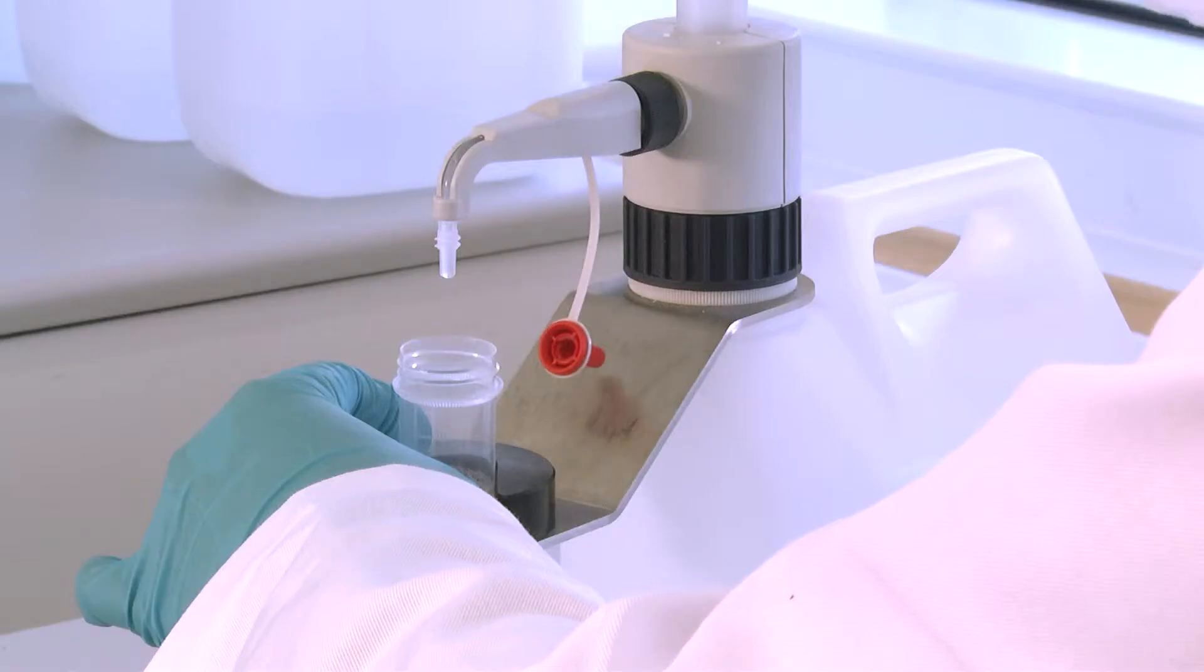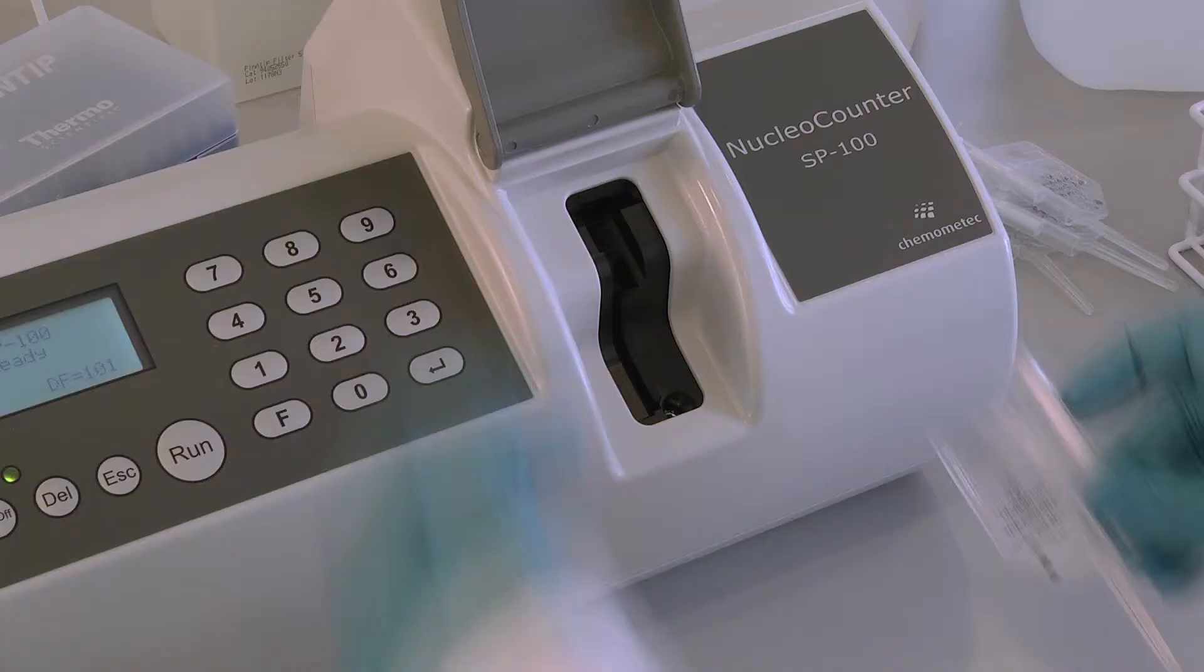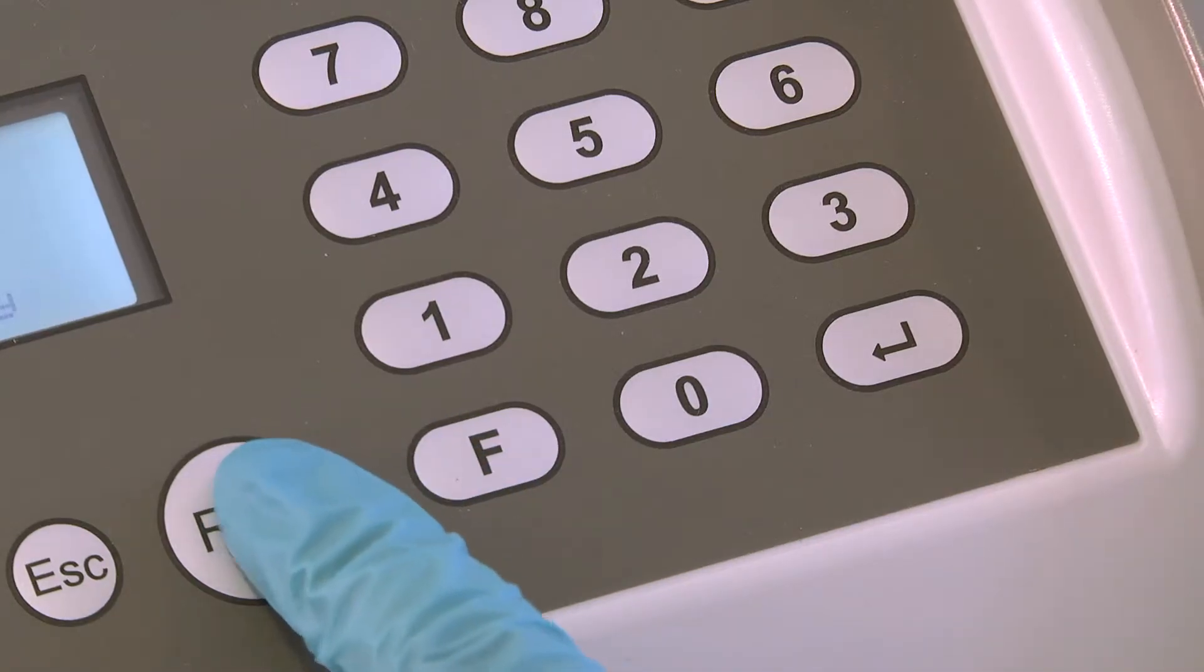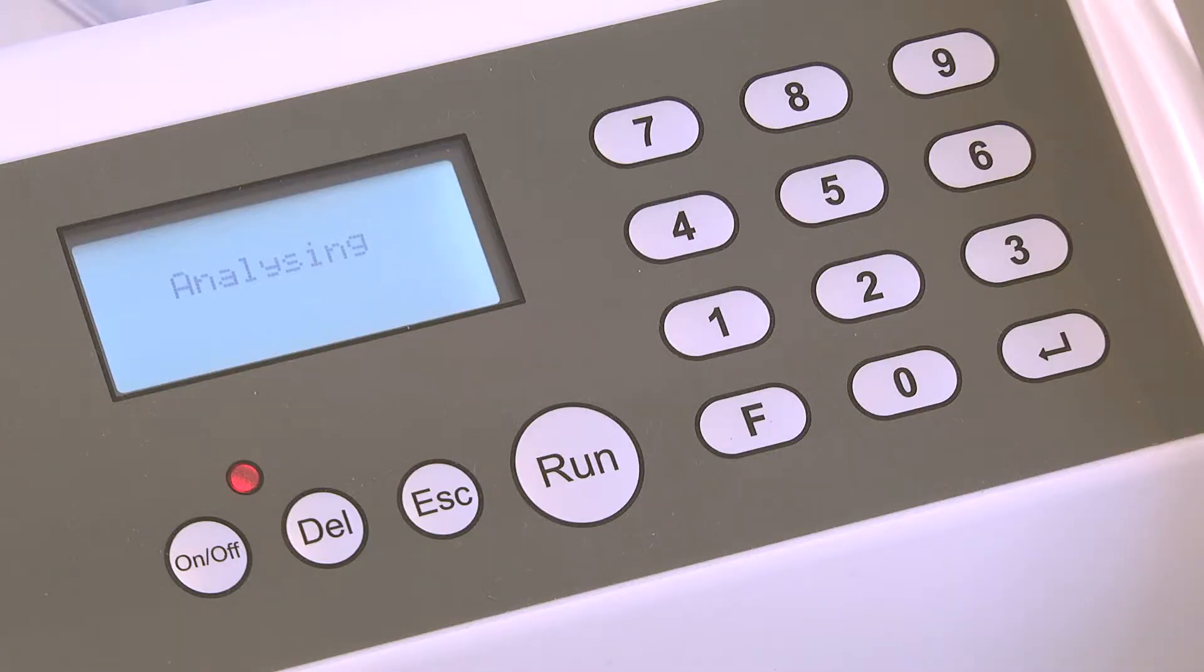To measure viability, just repeat the process with PBS. The SP100 shows the non-viable cell count and the percent viability can be calculated.